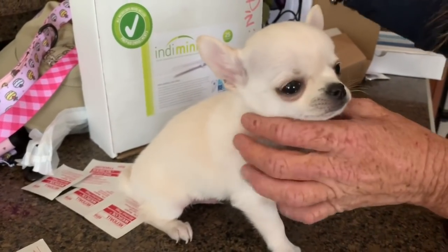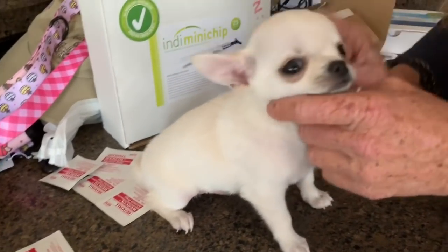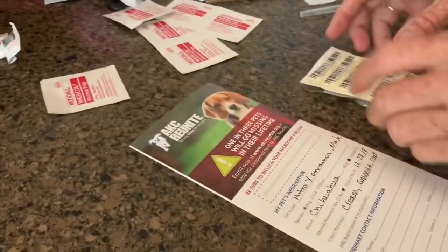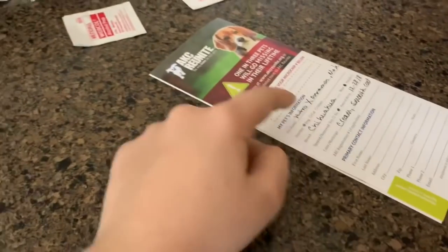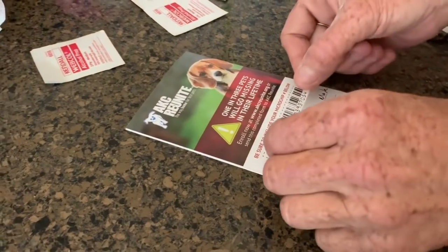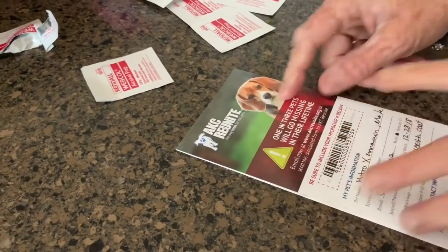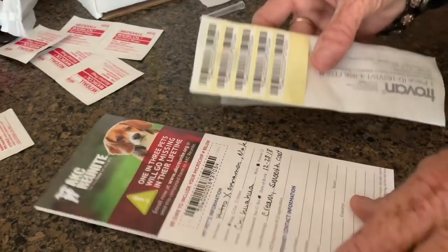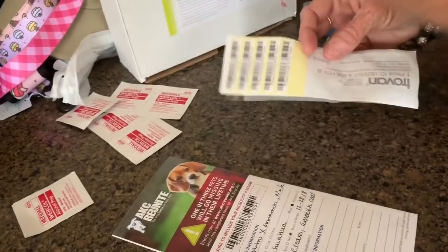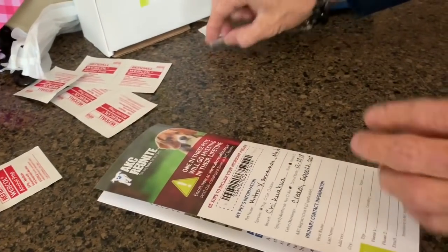After we microchip him and he's settled down — he's a good boy — we're going to give him a little treat. We've already filled out the form with his identification: basically who he's out of, his color, his sex, and all that stuff that's going to identify him. We'll put his AKC number in there also when I get that, and I'm going to place his microchip number on this. We'll keep these with all his paperwork — put this on his AKC registration papers and then also give it to his new owner. I'll keep copies for my own records and give that to his new owner so he can give them to his vet and use them for identification for his baby.